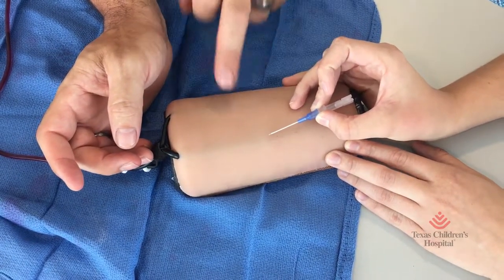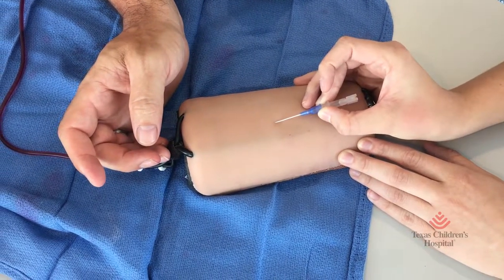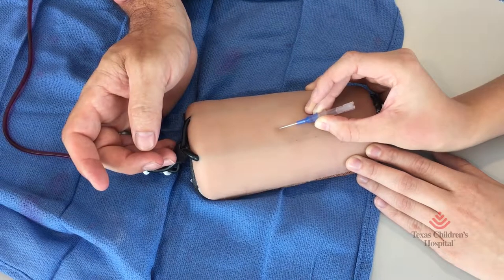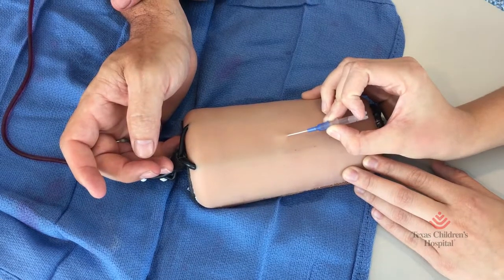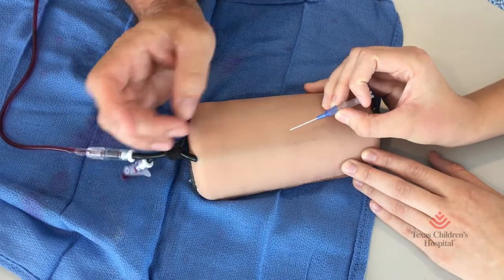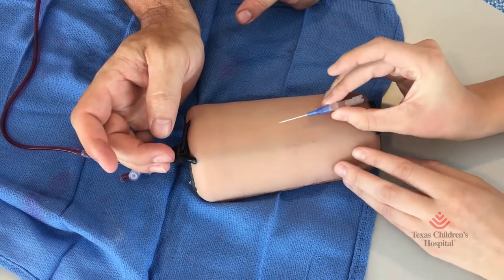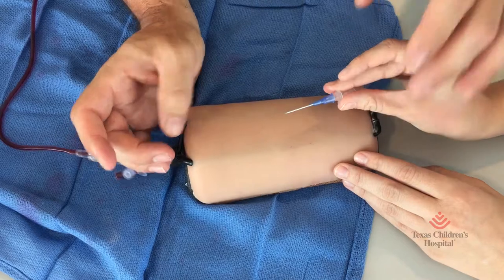I want to see you go in and out just of the skin — don't hit the vein. Just kind of pierce. You'll see people trying to do some first hit. Go in all the way, just practice going in all the way. And then back it off. If you try to start too low, as you'll see some people trying to do — can you put a little more spring in these two fingers?